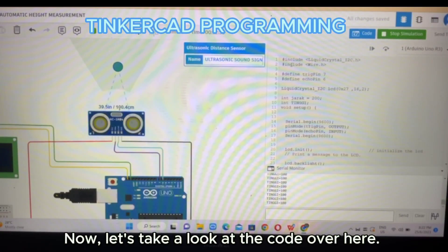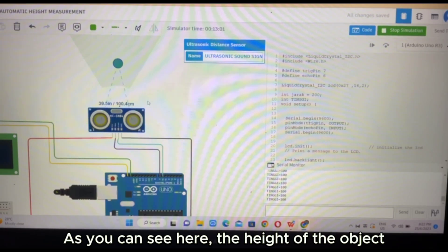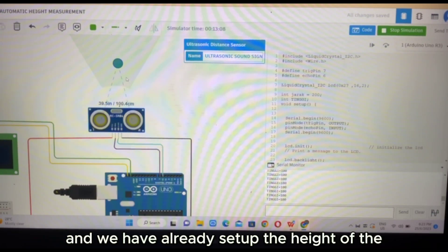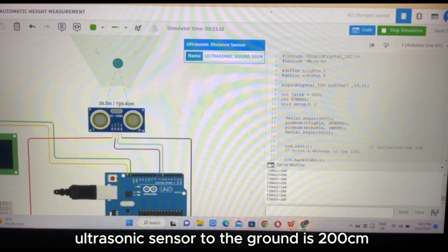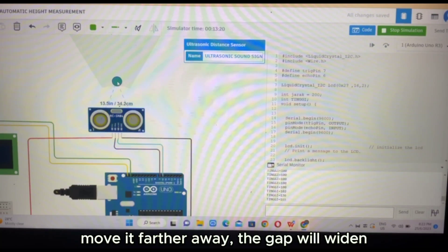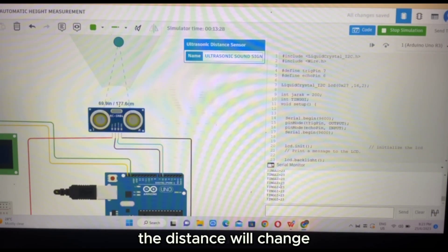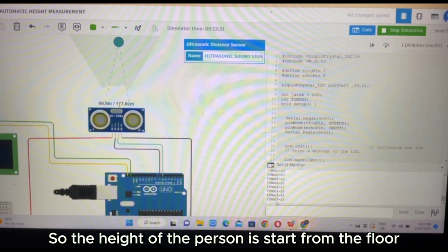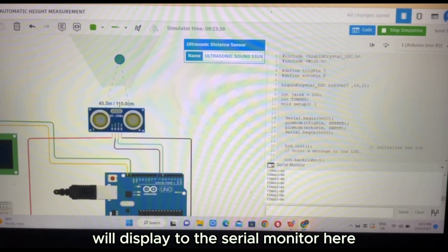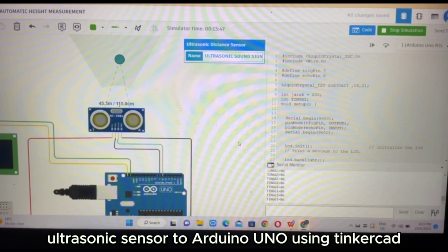Now let's take a look at the code over here. We move to the output display on the serial monitor. As you can see here, the height of the object to the ultrasonic sensor is 100.4 centimeters. We have already set up the height of the ultrasonic sensor to the ground as 200 centimeters. If I move it closer, the gap will narrow, and if I move it further away, the gap will widen. In other words, whenever I move the object, the distance will change. So the height of the person starts from the floor or ground to the object, and the height will display on the serial monitor. That is the explanation of how to connect the LCD and ultrasonic sensor to Arduino Uno using I2C.